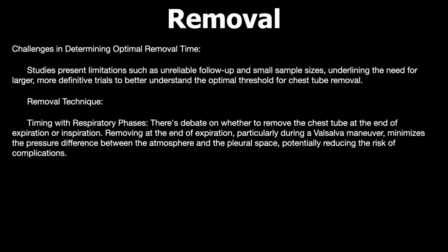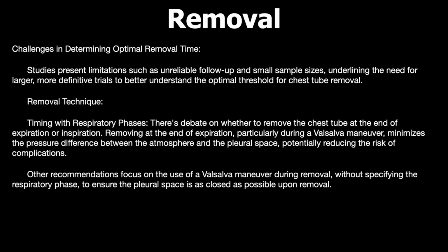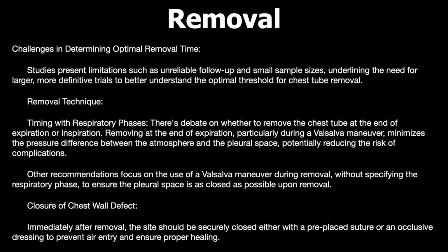So you can remove it at any point of respiration if you want. Other recommendations focus on the use of Valsalva maneuvers during removal without specifying the respiratory phase, to ensure that the pleural cavity is closed as much as possible upon removal. Now, the closure of the chest wall cavity defect. Immediately after removal, the site should be properly secured either with a pre-placed suture or an occlusive dressing to prevent air entry and to ensure proper healing.